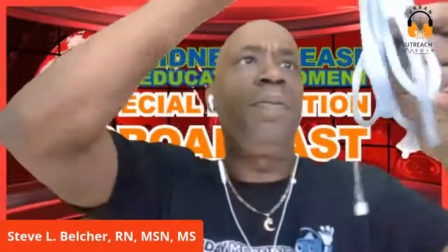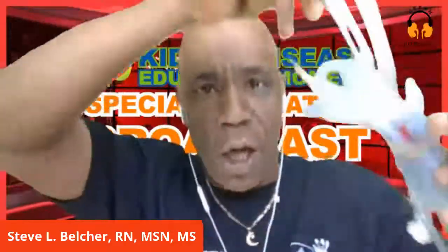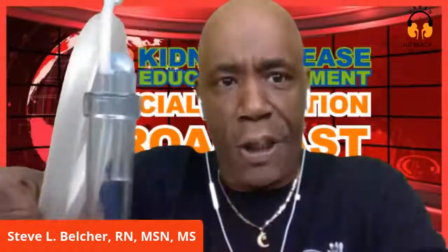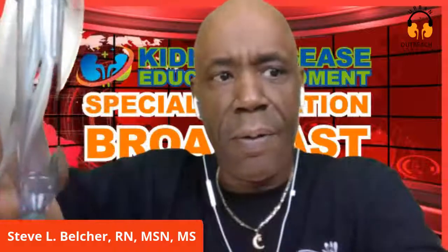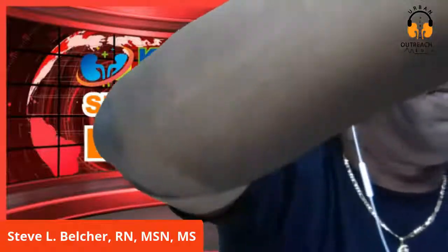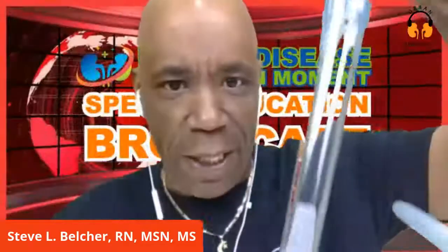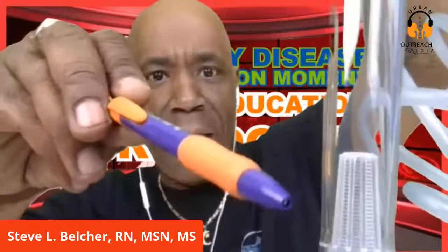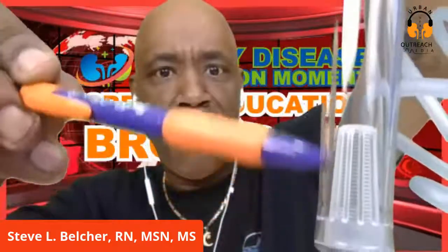Let me show you the air traps. In the arterial line it would be here, but this one doesn't have an air filter in it - this is the arterial. And this one is the venous. This is the filter they're talking about right there - that's supposed to trap some of the air.